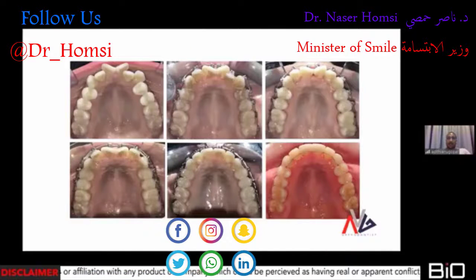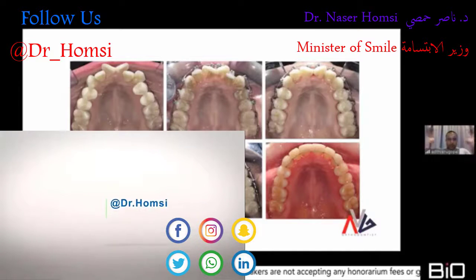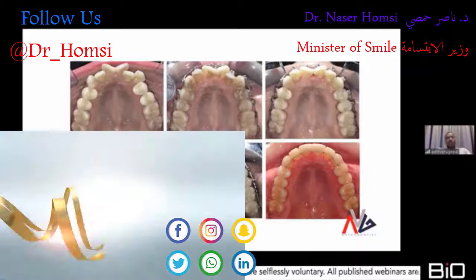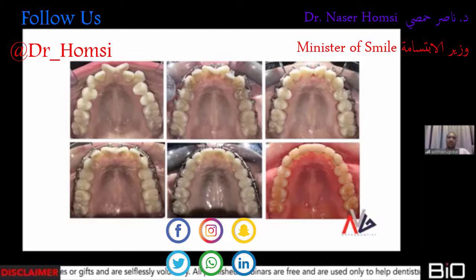Although I did a lot of IPR sequentially in this case, at the areas of different crowdings, as you can see, for example, I started off with a little bit of IPR over here and a little bit of IPR over here and all these things in order to not lose anchorage, because if I would have IPR'd everywhere, I would have just lost anchorage because all the teeth would have probably moved forward and I would have lost the benefit of interproximal reduction. So I had to do a sequential interproximal reduction, used light wires, had a lot of issues with this particular case, especially in terms of controlling the anteroposterior inclination.